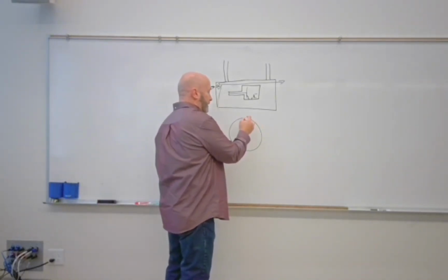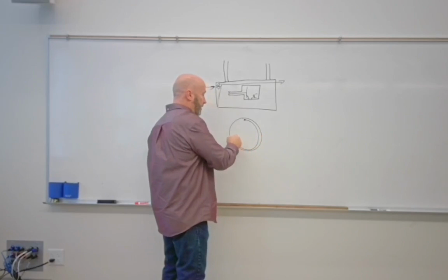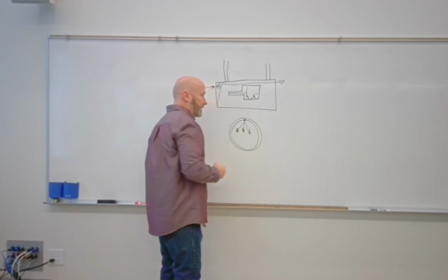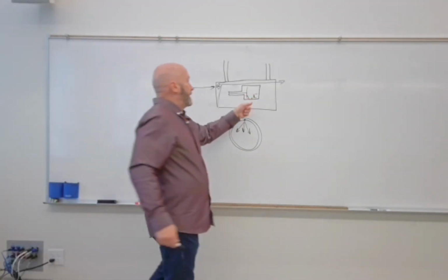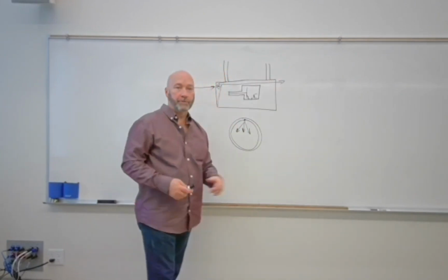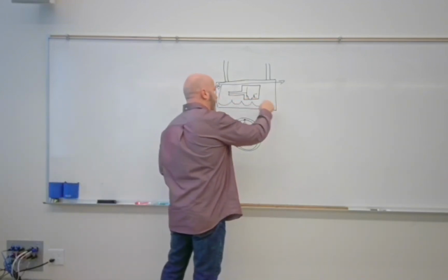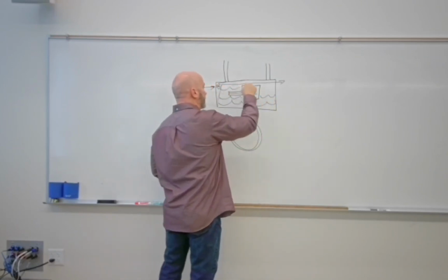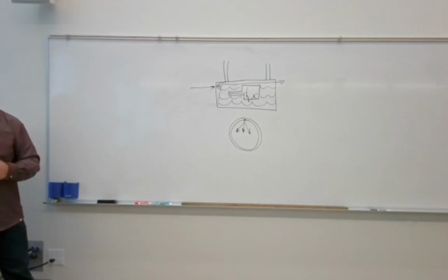So the heat, though, does not just stay in that one spot. First off, we're going to rotate this around and around, which is going to spread the heat out all the way around that, but it's also going to spread that way, which is spread by touching, which we refer to as conduction, right? So thermal radiation, conduction, thermal radiation, convection. We got all three of those things going on inside of the housing. And of course, we've got the oil inside that we're going to also conduct the heat into and then convect it off of. Right? So all of those things are going on inside of your housing.